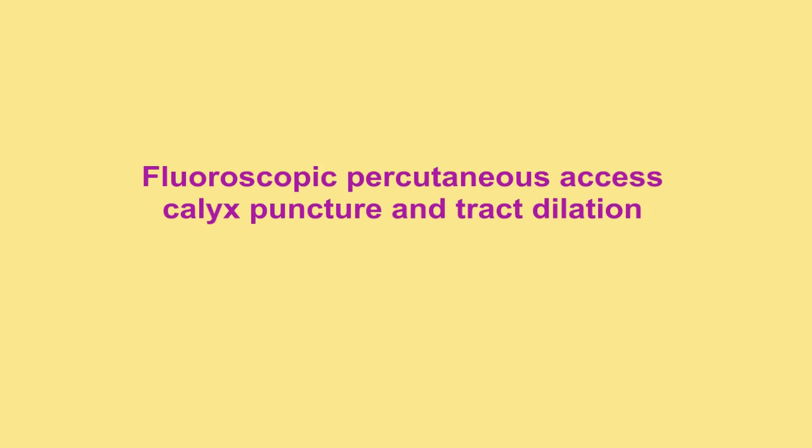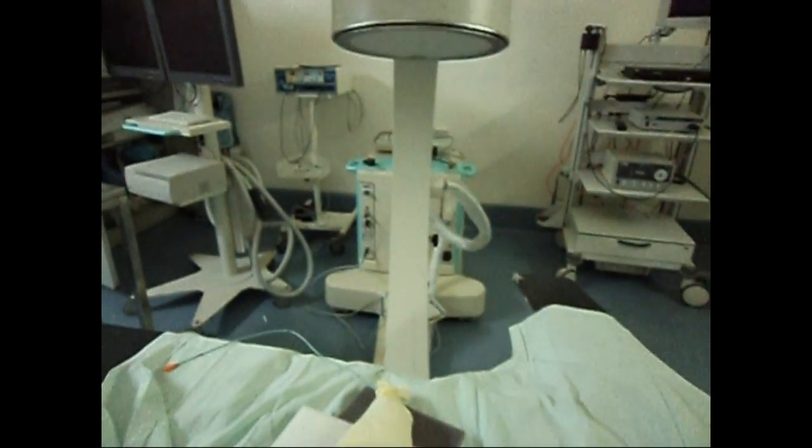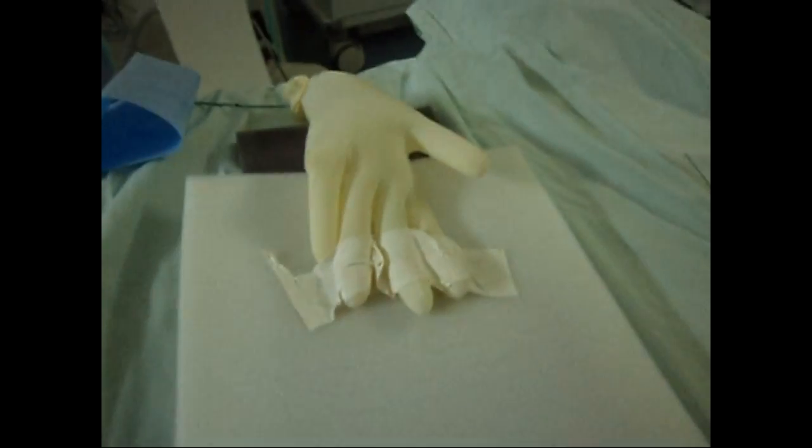A latex glove is used. A urethral catheter is inserted in a glove and the glove opening is closed. Two or three foam layers are used to simulate the abdominal wall. The glove is placed on the foam with the fingers looking toward the middle.